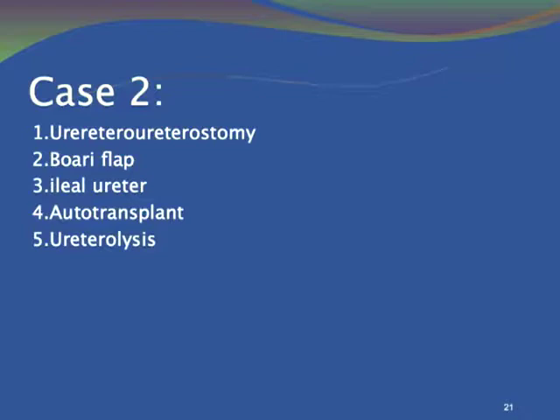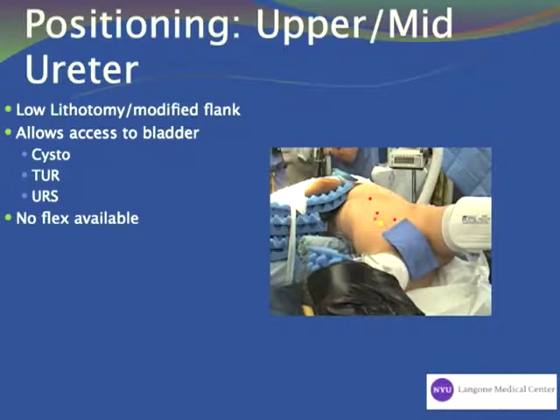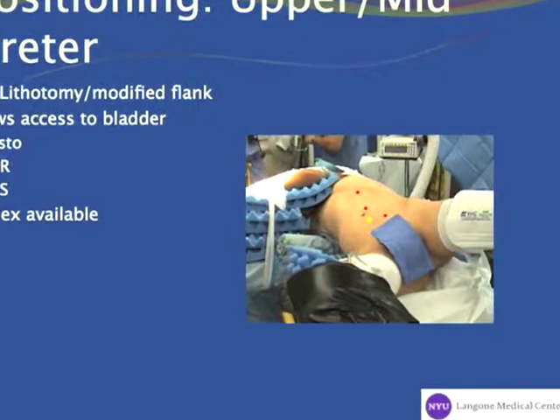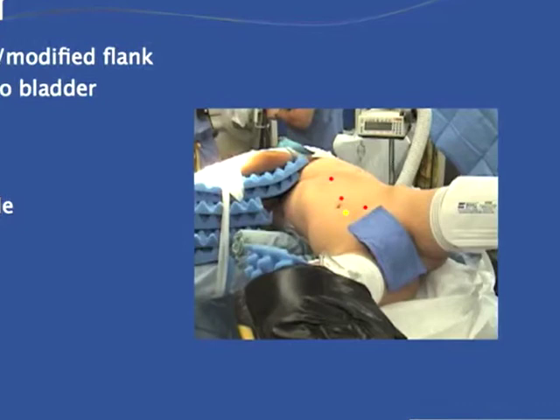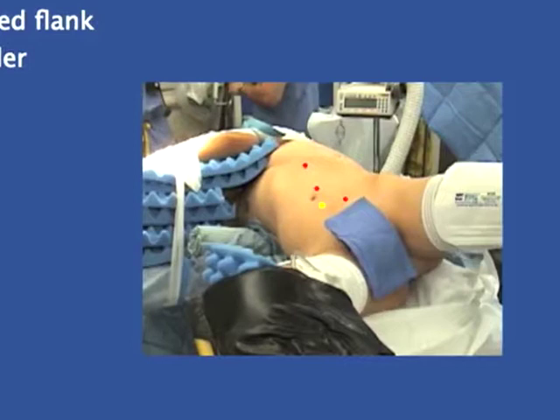We prefer a low lithotomy modified flank position that allows access to the bladder as well as allows the robot to come from the flank or from the feet. In terms of trocar configuration, we put our camera port just lateral to the umbilicus, spread our left and right arms as far apart as possible, and then place our assistant port — typically a 5-millimeter trocar — just above the suprapubic area.